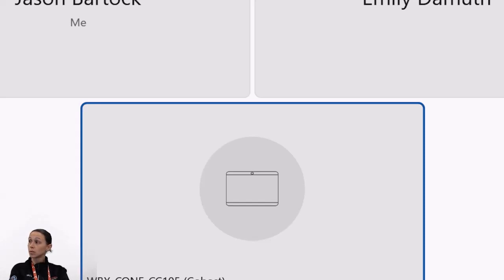So now you're adding arterial return to help provide hemodynamic support. The other scenario is you're already on VA ECMO, but you're having trouble oxygenating the patient because now their lungs are bad. And so you put another return cannula into the venous side, so you're both returning blood, venous and arterial. The configuration's the same, but the reason why you might start it may be slightly different. Make sense? Yeah.